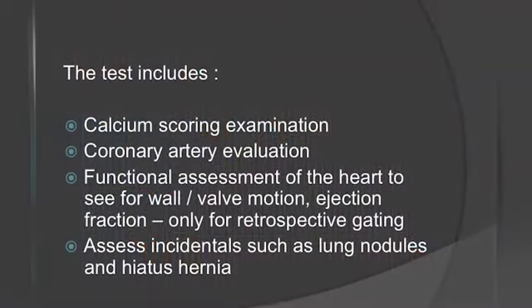The test itself is not just limited to the coronaries. The test also evaluates the calcium burden in the coronary arteries, what we call calcium scoring. Obviously, it evaluates the coronaries. We can also do a functional assessment of the heart. We can see the heart beating. We can evaluate the valves, the wall motion. We can even see microperfusion of the myocardium. And it's much more holistic in the evaluation of the heart.